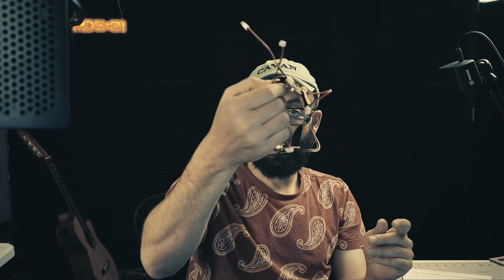But I think this is just a dev kit for right now, so we're just doing it individually. But that is a good improvement that we might want to make. For now, in its current form, I think it's fine because this is mostly just for experiment, research, and development. But if you wanted to turn this into a full-fledged prosthetic sensor, you would definitely need to do that.